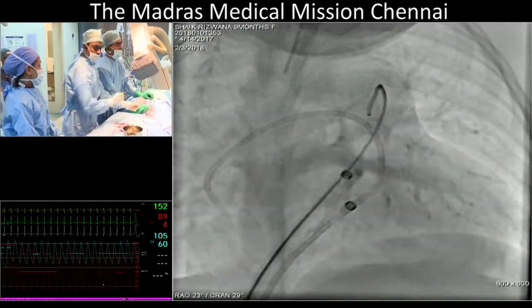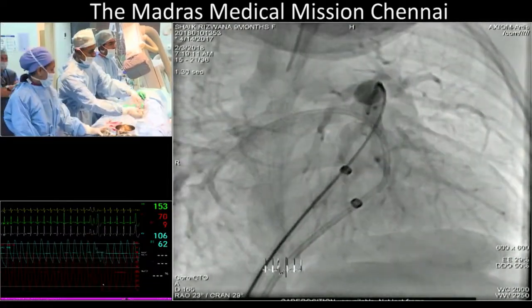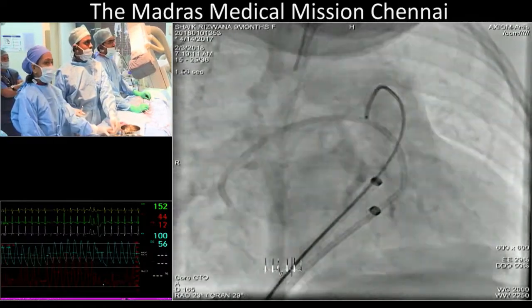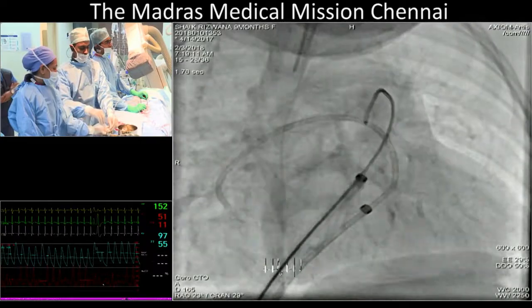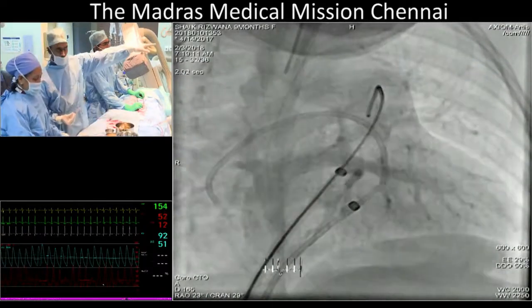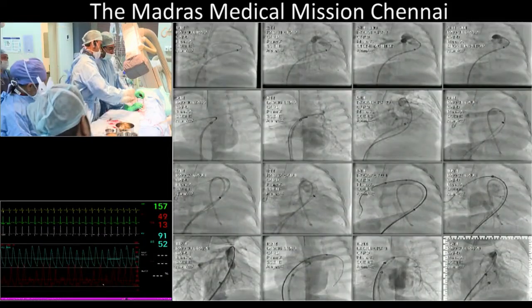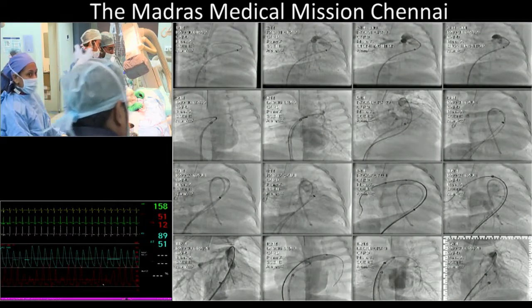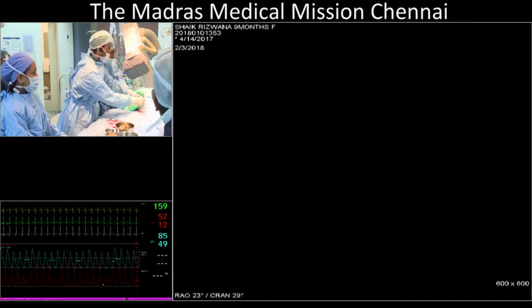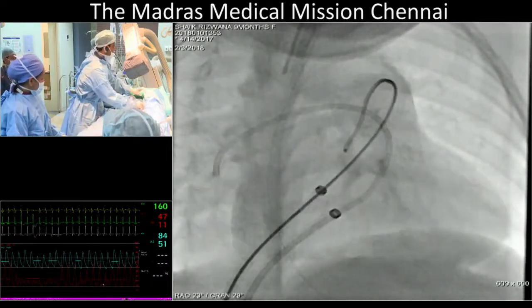It could explain, but in this patient you can see peripherally there are multiple branch pulmonary, lobar or segmental branch stenosis. And I guess if we decide to put a stent in the left pulmonary artery, I might do so for the right as well, because we will go anyhow each time to dilate the left stent. We have to finish the job at the same time if possible. Yeah, I would still try and avoid stenting as much as possible and either work on this with a next size up balloon, maybe 10, at low pressure, and then stop.